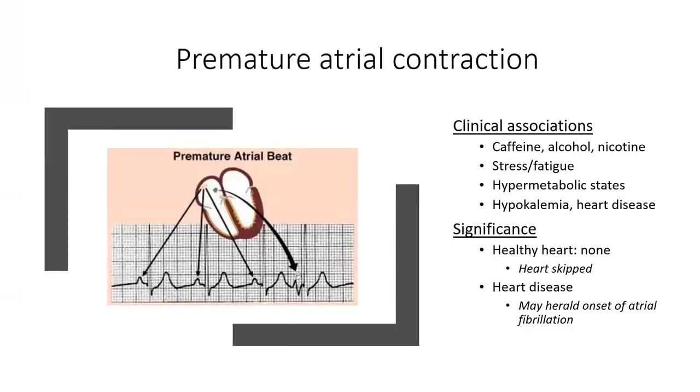Next we're getting into premature atrial contractions. Your ventricular and atrial rate depends on the underlying rhythm, so this one really depends on what's causing it. Ventricular and atrial rhythm is irregular due to early P waves, creating a PP interval that is shorter than others. QRS shape and duration: the QRS that follows the early P wave is usually normal, but it may be abnormal and it may be absent.